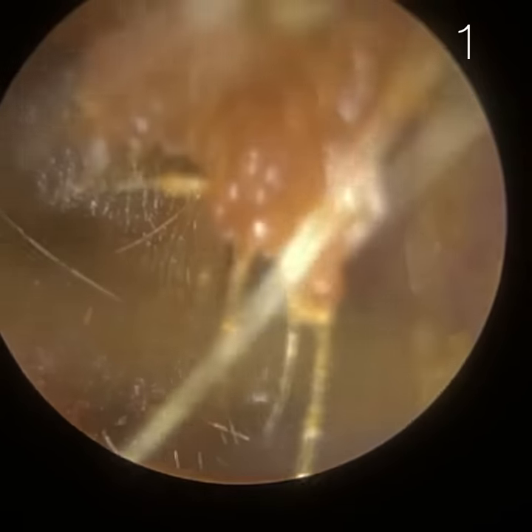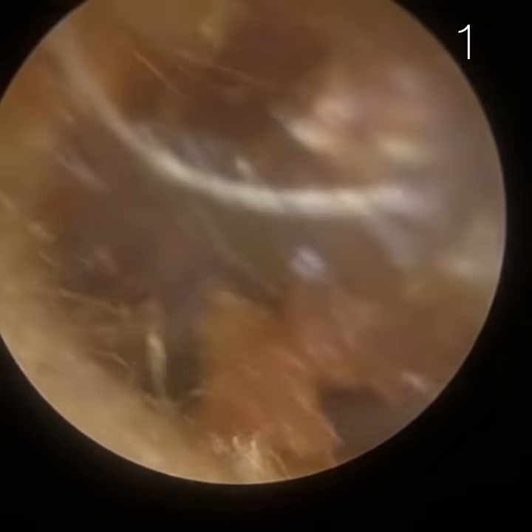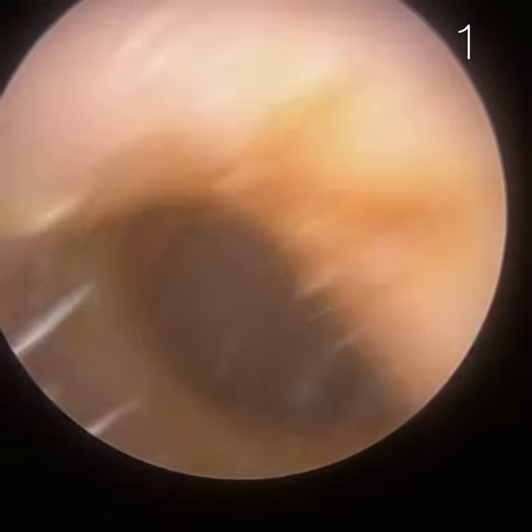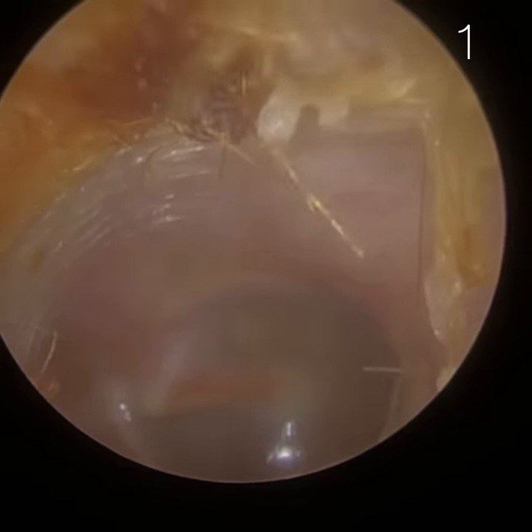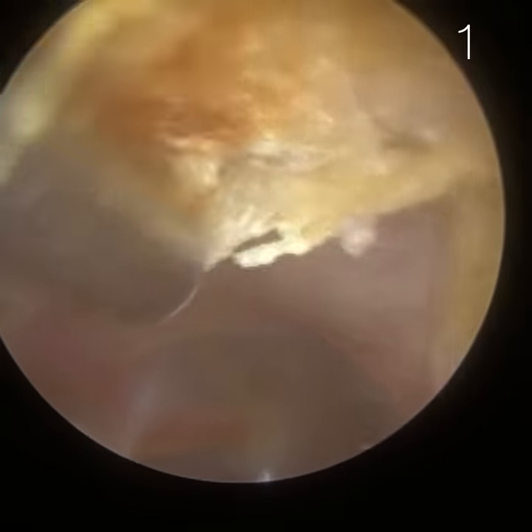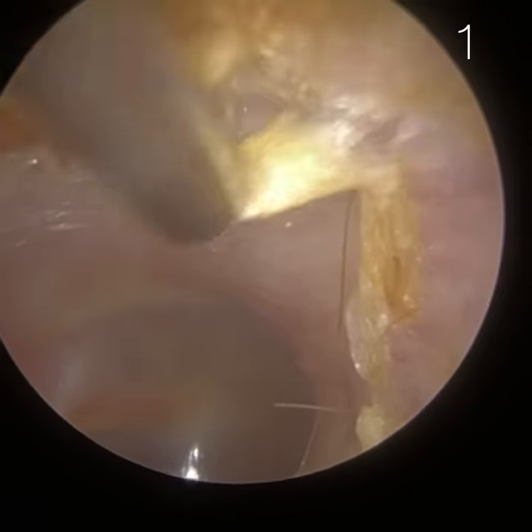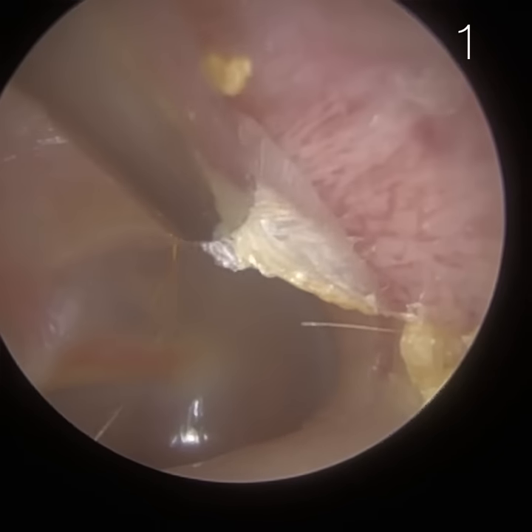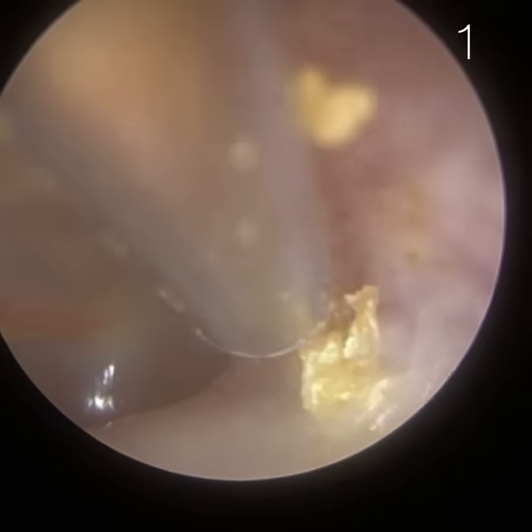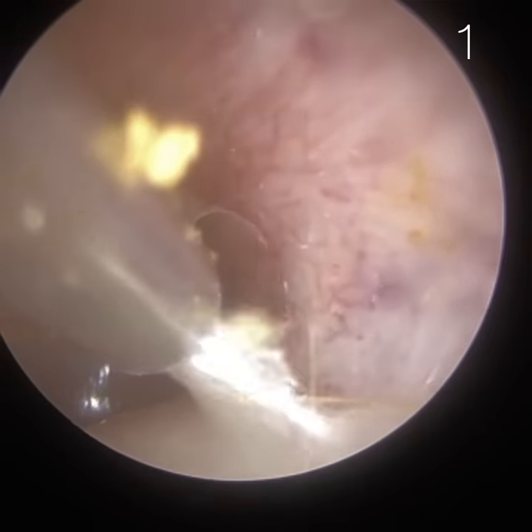Even at this stage, the patient's able to hear significantly better, because the ear is no longer occluded. There is an opening in the ear canal for sound and air to enter, and for sound waves to hit the eardrum in order to vibrate it. We've just got some peripheral dead skin just around the edge and the cartilaginous portion. We'll just use the fine end and glide around — if it comes away, brilliant; if not, completely fine. The eardrum is intact, though I think there is a very mild retraction. You can see some dead skin starting to peel away towards the eardrum as well.